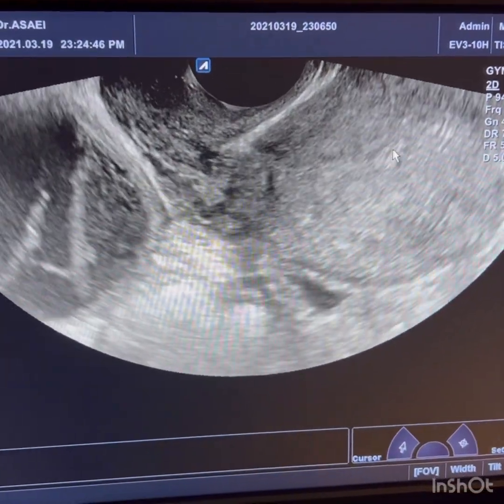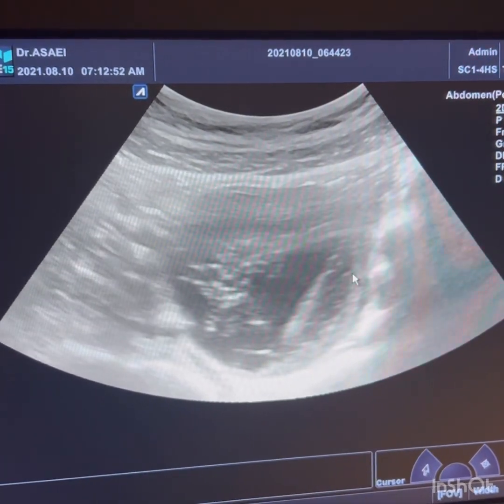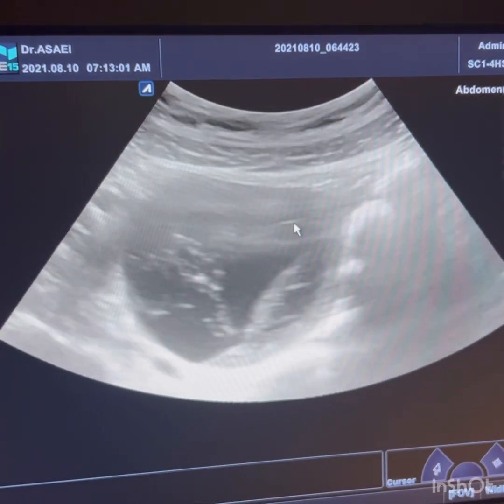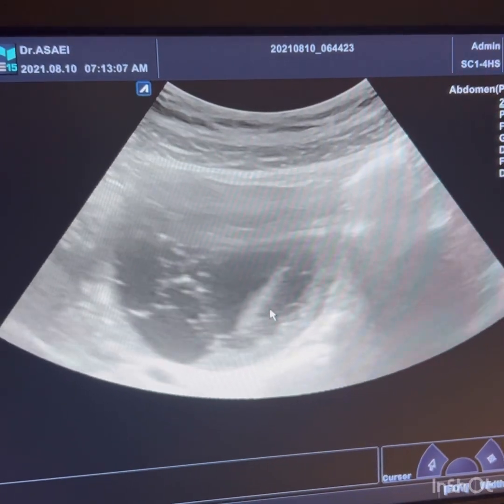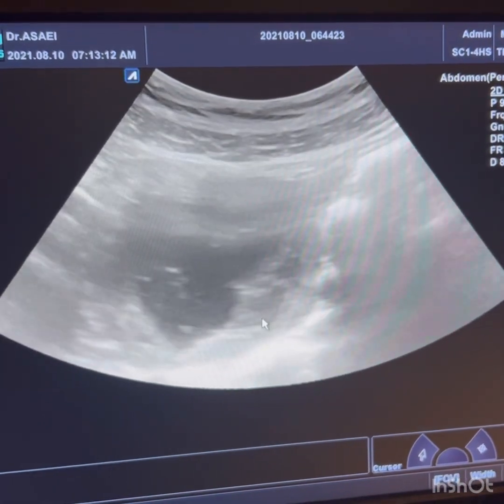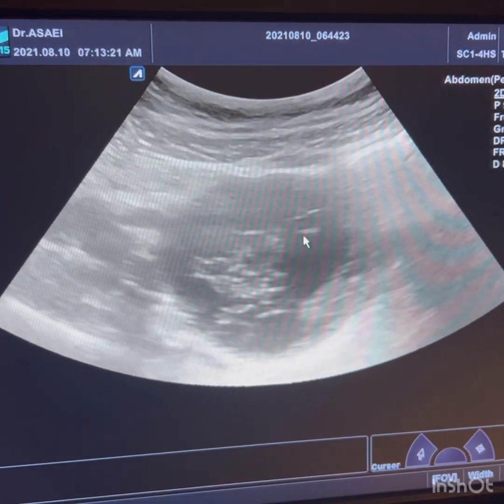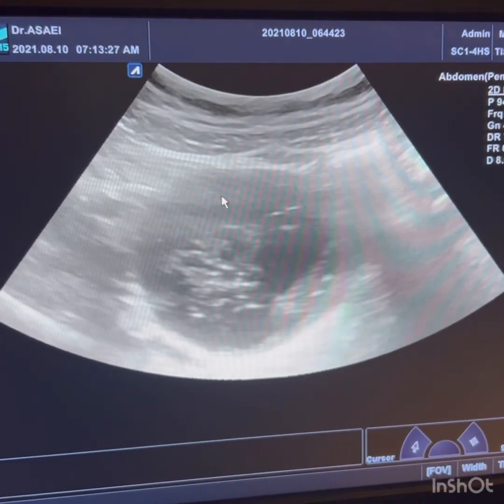and normal endometrial line. Here is again another case with hemorrhagic ovarian cyst. We can see the thin septa and internal echoes inside the cyst. Internal echoes inside hemorrhagic cyst may resemble solid component, but it has no internal vascularity, which can help us differentiate it. Also, hemorrhage has low level echo and no mass effect.